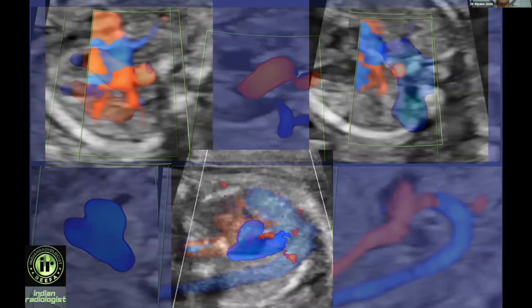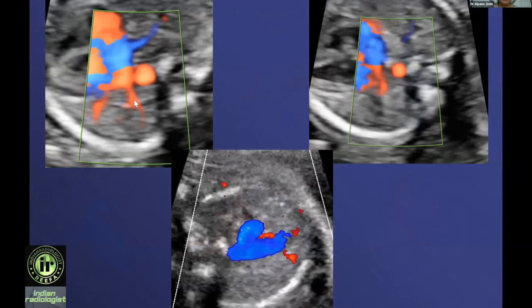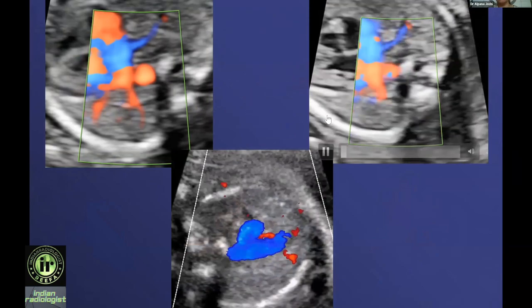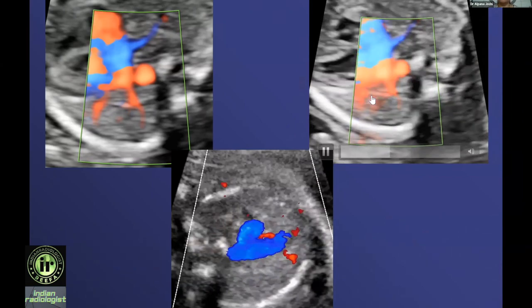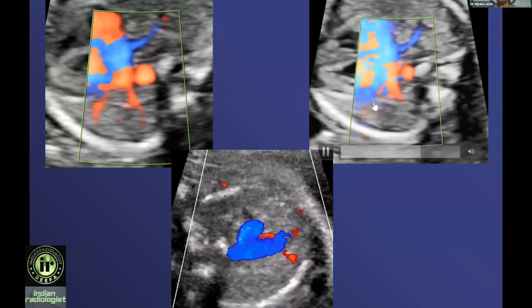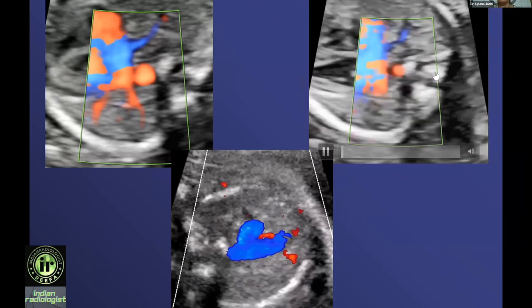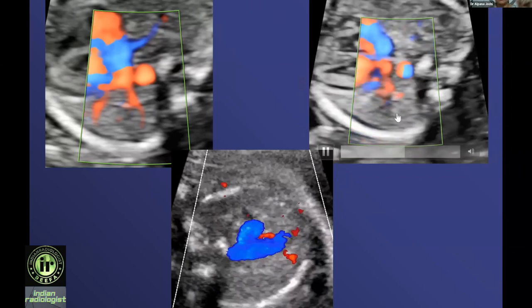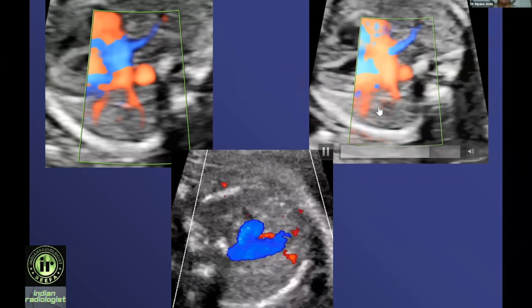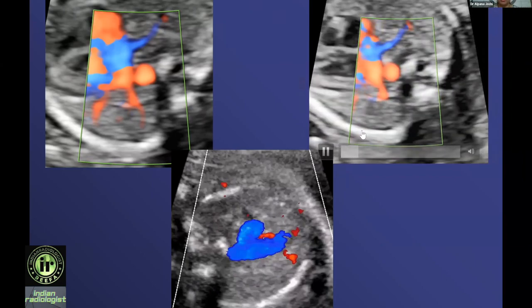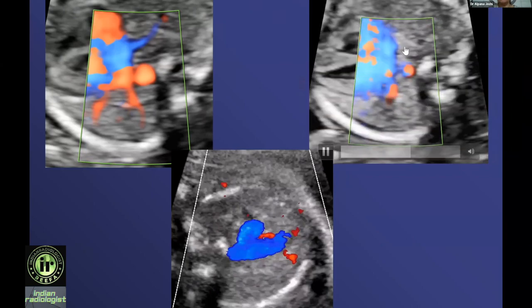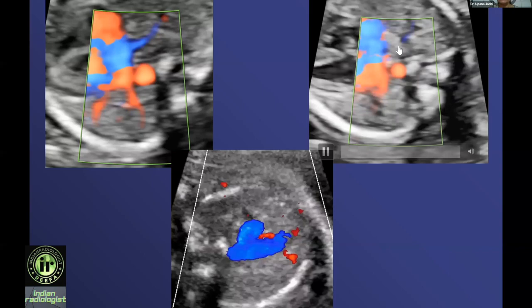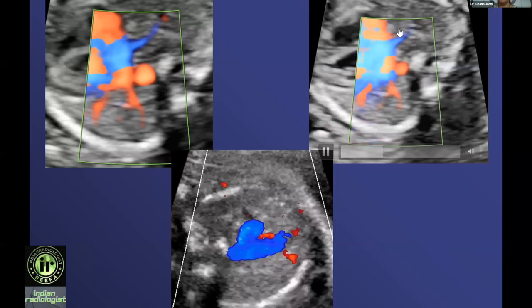The pulmonary veins are mandatory to show — only two pulmonary veins need to be shown — but with good machines and power Doppler, bi-directional power Doppler, reducing the scale and making your box a little smaller in size, it will really show you all the pulmonary veins beautifully. This is one set of pulmonary veins, and here you can see only one in this view, but if you adjust your transducer you will be able to see both.